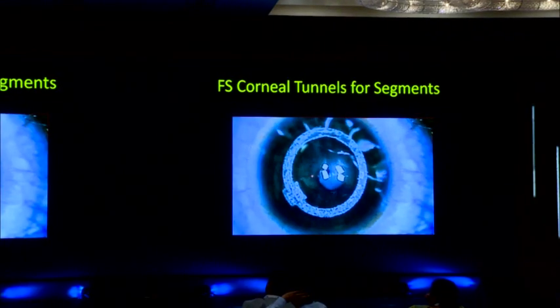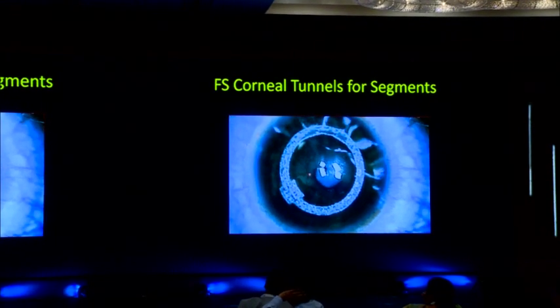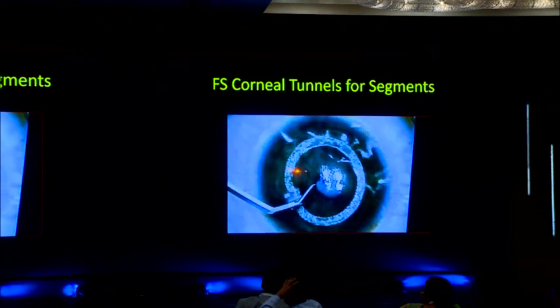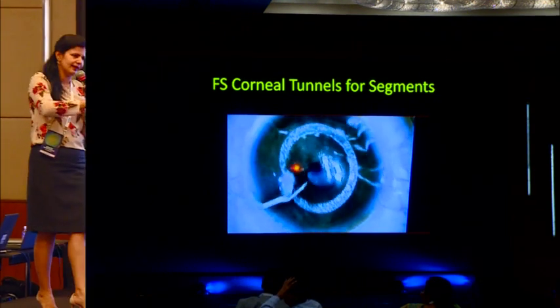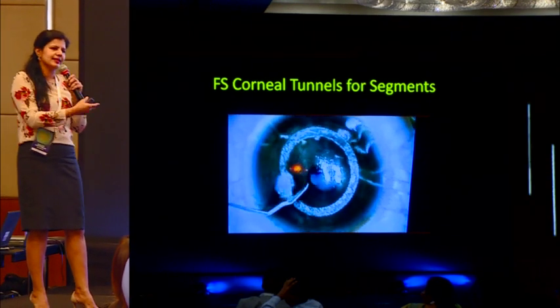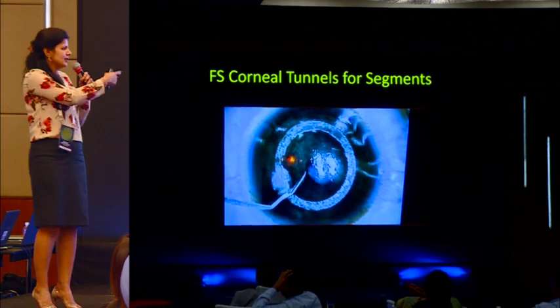I also use it for keratoplasty, and this is for intacts. Here in intacts, it basically takes a channel along with a platform. You have a channel which is approximately half the size of the platform, to make the incision and also to ease the insertion of the intacts into the channel.